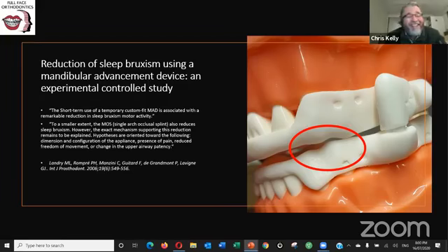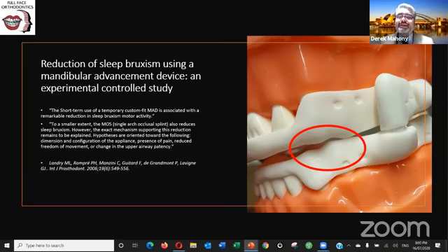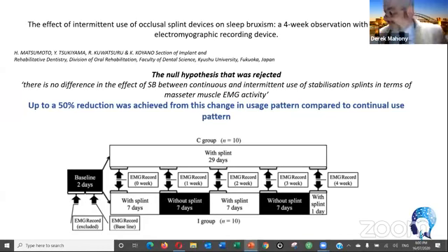Excellent. Let me put this slide up, because this also shows how dentists can make their even flat plane occlusal splints more effective. You talk about that, I'll go and get my appliances. Hang on. The previous slide did show a pivotal contact, and I think that's critical in stopping patients from parafunctioning on a stabilization kind of point. So the further back the point of contact on the splints between the upper and lower arches, in a person who has any type of REM behavior bruxing, the more likely they are to continue to clench on that at night.